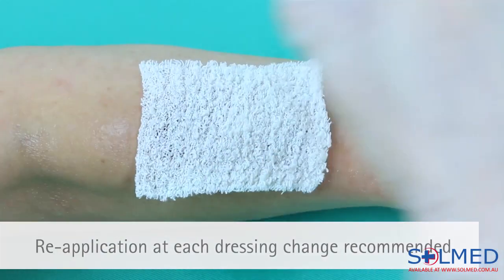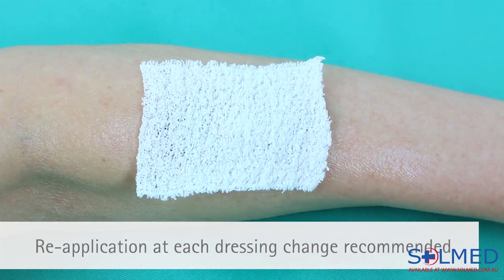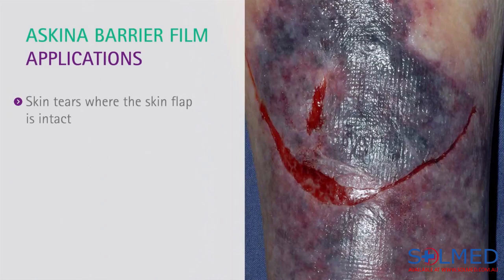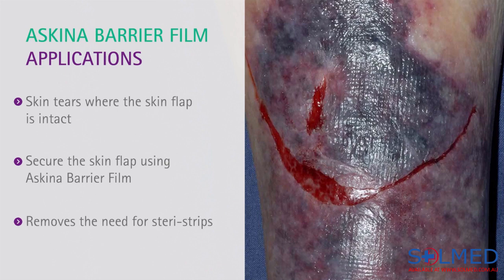B. Braun recommends reapplying this product at each dressing change. Skin tears where the skin flap is intact can also be treated with this product. Once the skin tear has been cleaned and the flap realigned, you can secure the flap using the barrier film. This removes the need for Steri-Strips, which can often reopen the skin tear when removed.